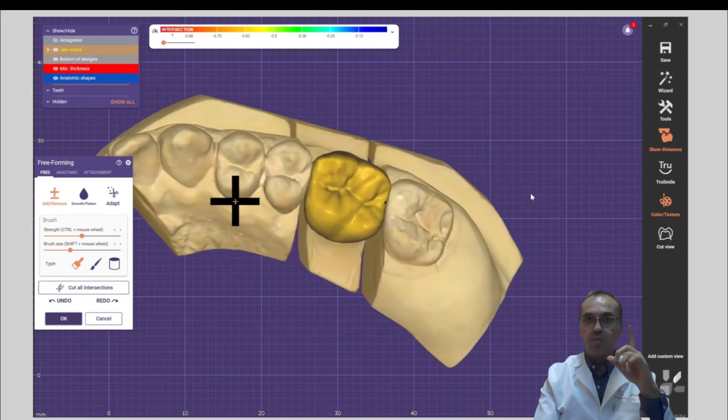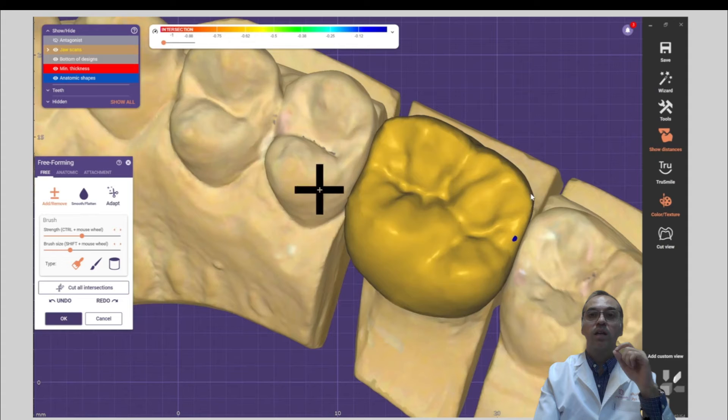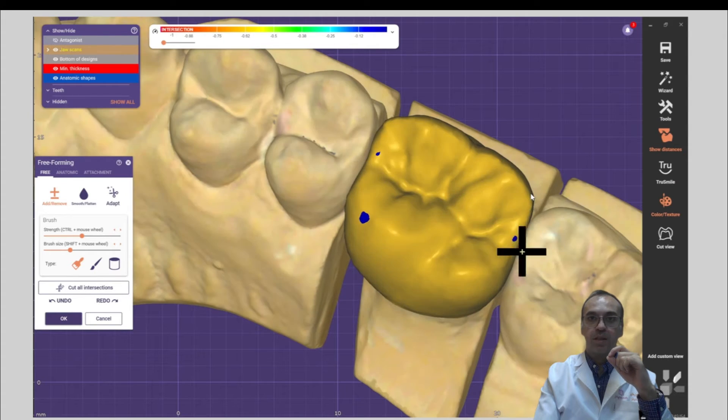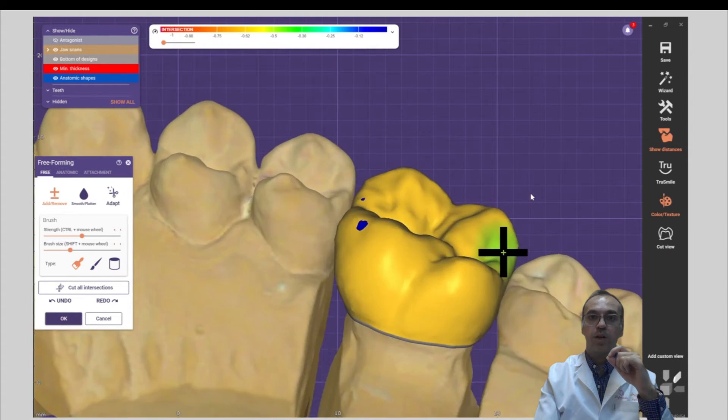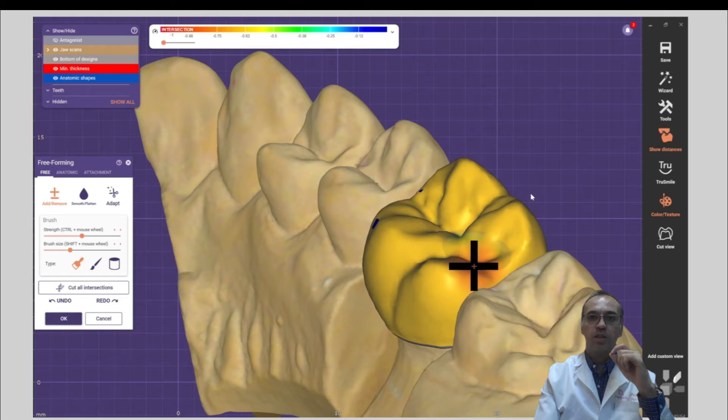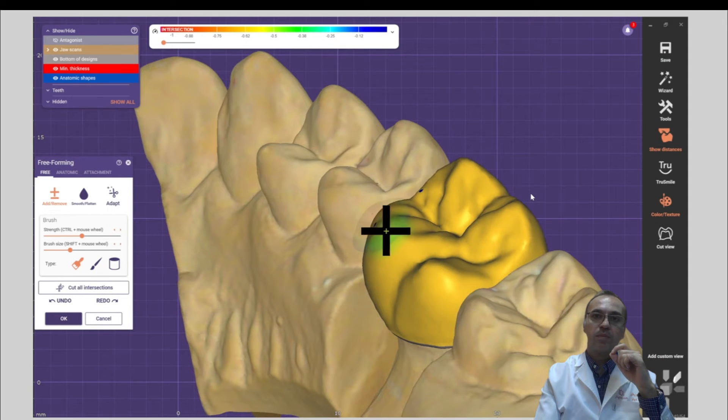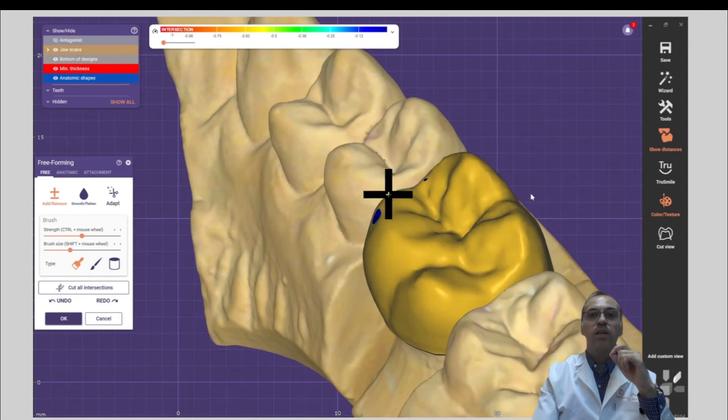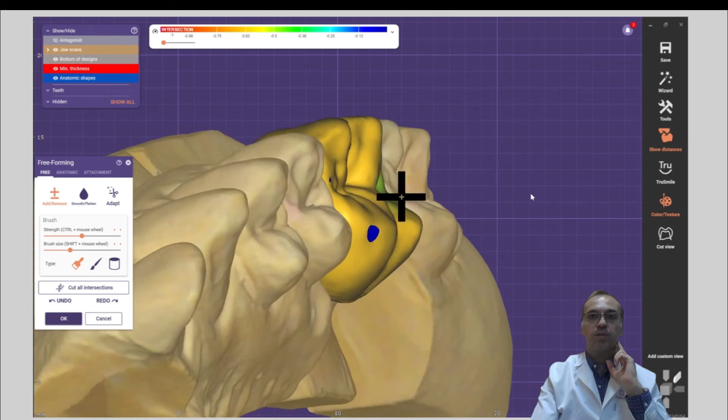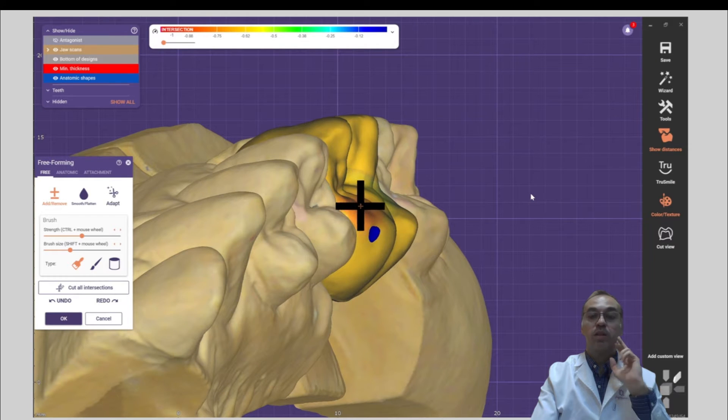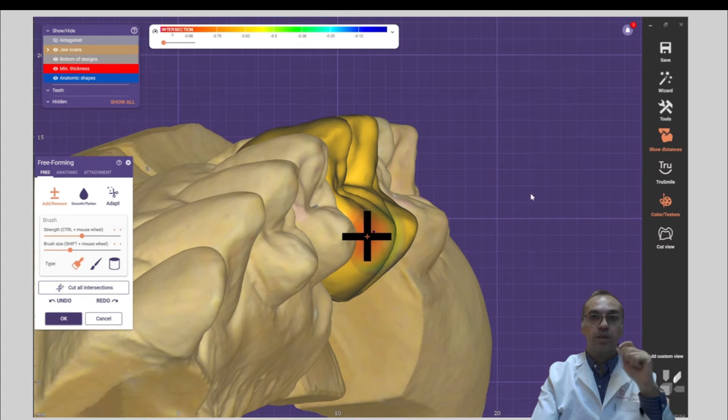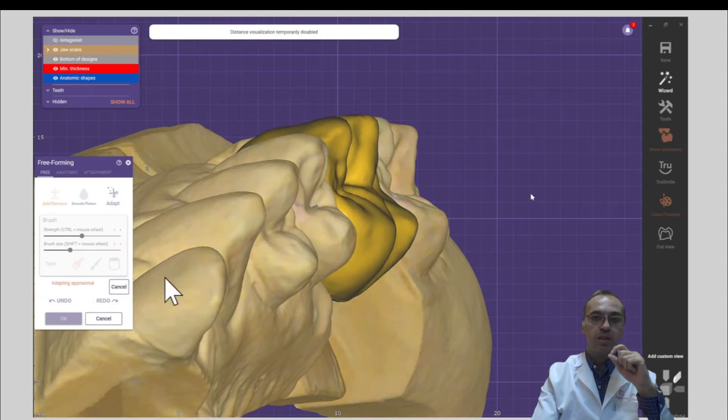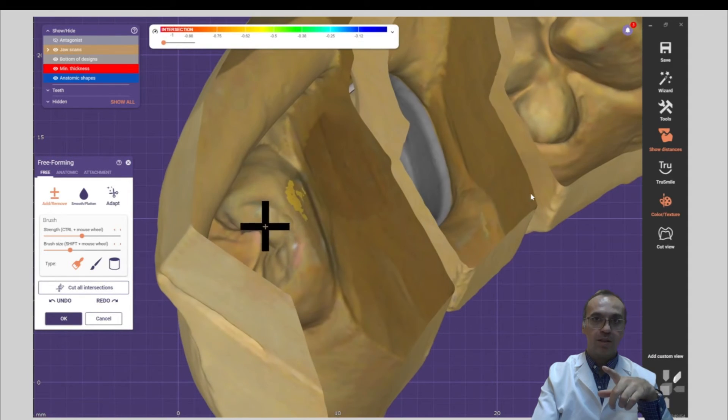And of course, one more important thing is having leveled marginal ridge. Uneven margin is one of the most sources of food impaction. And of course, in case you want to go for less quality, you should take care of the marginal ridge.